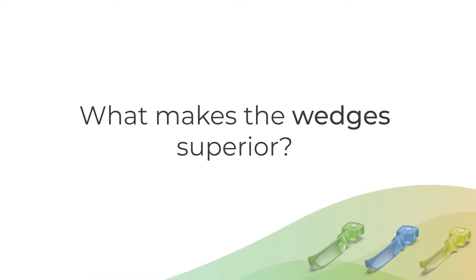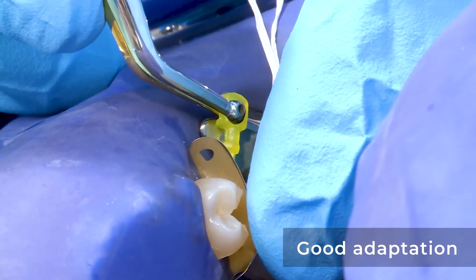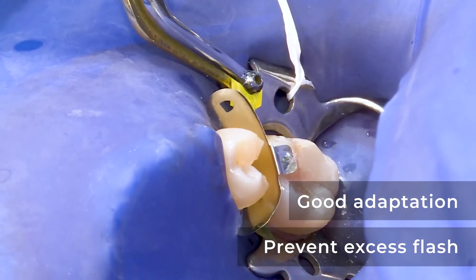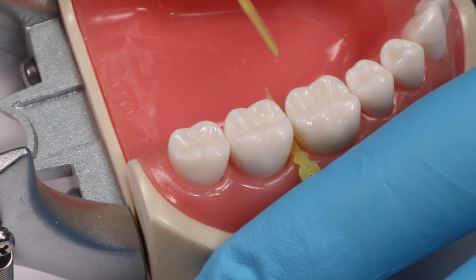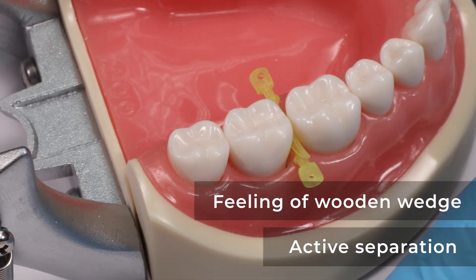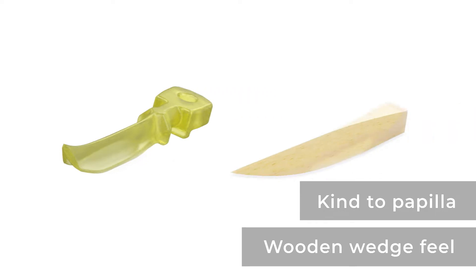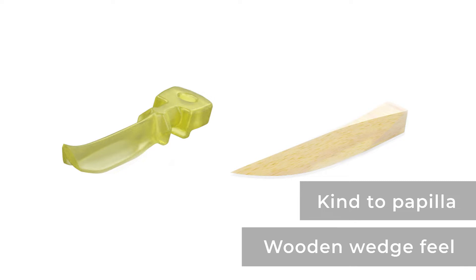The new Halo wedges are firmer. They are not as flexible as the plastic wedges we've been using. We all know that the basic thing a wedge does on a Class II restoration is to provide good adaptation of the matrix band into the tooth, so we don't have flashes or excesses. Halo wedges do that, but much more — they bring back the feeling we had with wooden wedges, which is an active separation. They adapt the matrix into the tooth in a way that doesn't harm the papilla, but brings back the active wedging feel that we don't have with standard plastic wedges. It's getting back the best of both worlds.